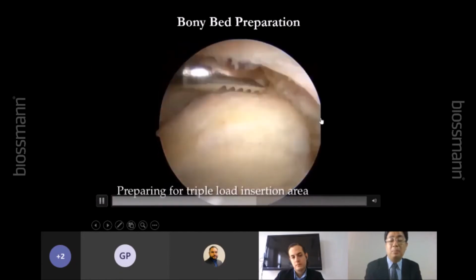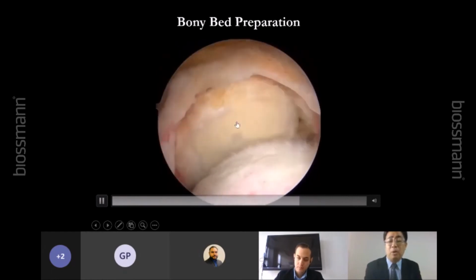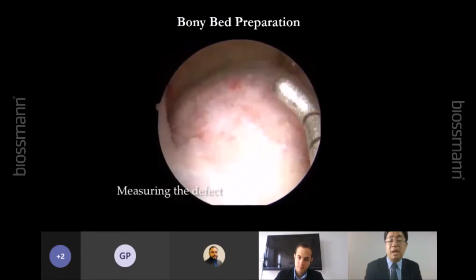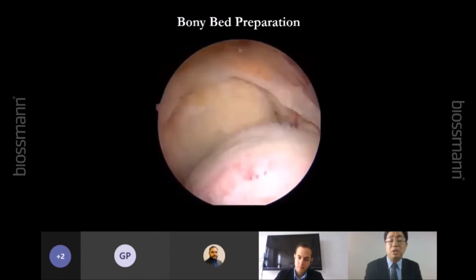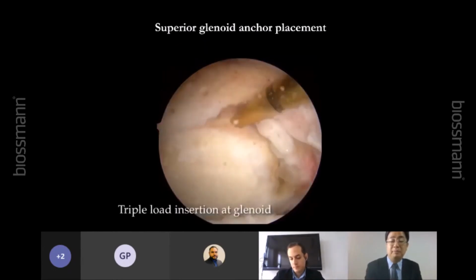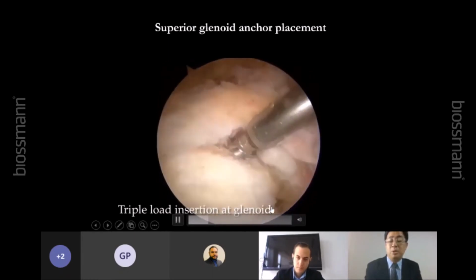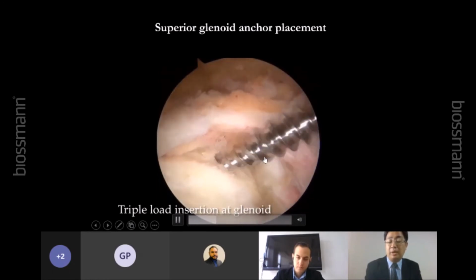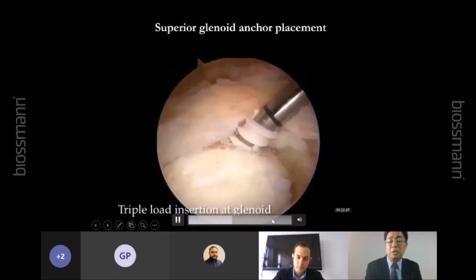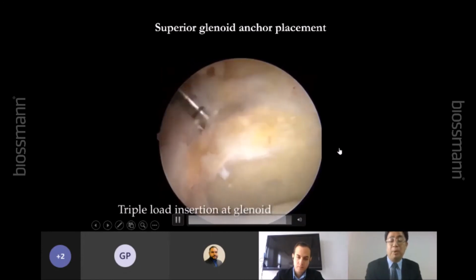Put 2 anchors on the medial side. I prefer using the triple load on the medial side. After preparing the bed, we measure the size of the tear. Most of the time it's about 4 centimeters by 5 centimeters. And put the medial anchors at the glenoid. I always use 2 anchors at the glenoid side, using the triple load anchors. Like that, 1 in the front, 1 in the back, triple load.